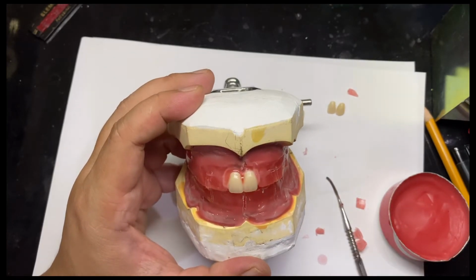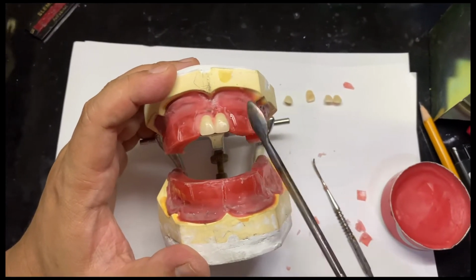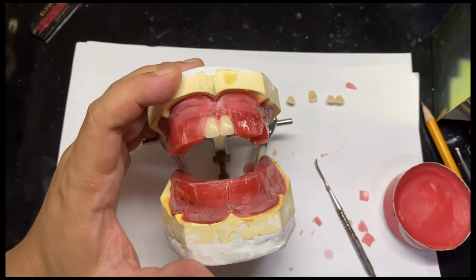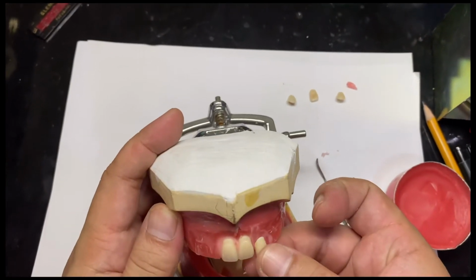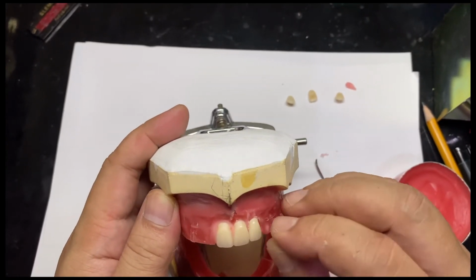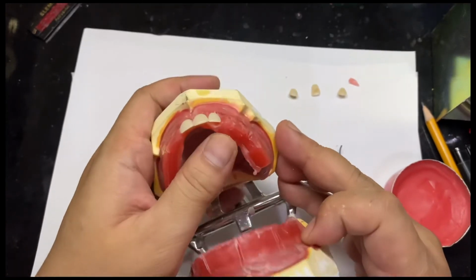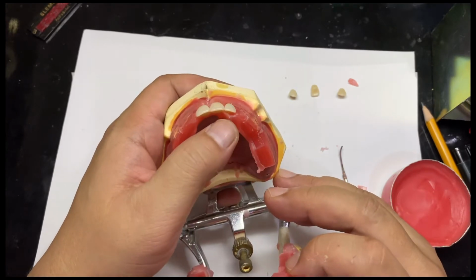Now next is the lateral incisor. For the lateral, same technique. Use your carver, soften the wax, and then set the lateral incisor. Again, the lateral incisor should be set 0.5 to 1 millimeter above the central incisor, and then a little bit in, neck in, incisal third in. View it from the incisal view. It should be a little bit in compared to the central incisor.